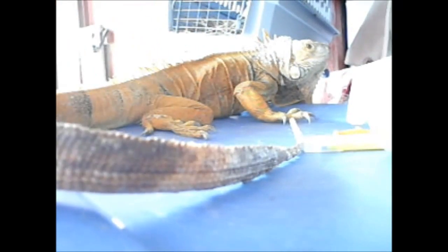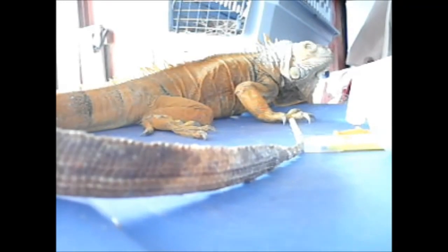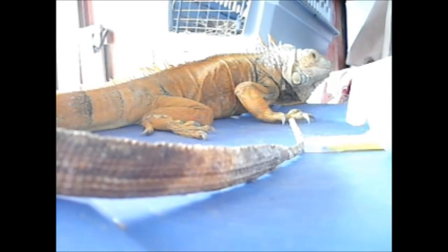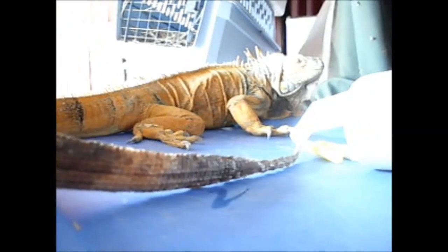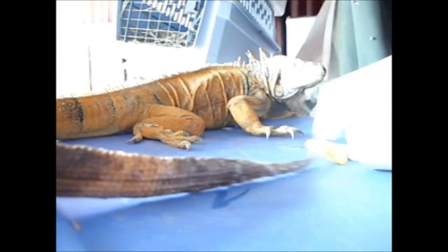Okay. That ought to do it. And we will give that just a minute or two to start to take effect. This is similar to lidocaine, but it's not as fast acting, although it lasts a whole lot longer than lidocaine will. And I don't know if you can see this here, but he's got an open wound here, a little bit of blood there.